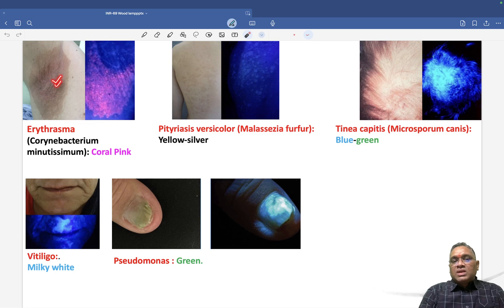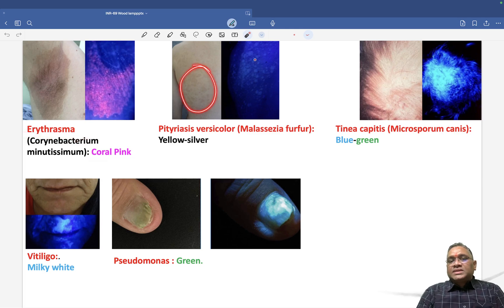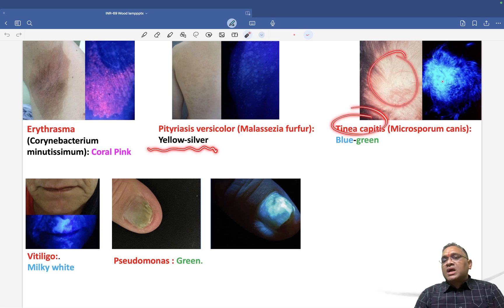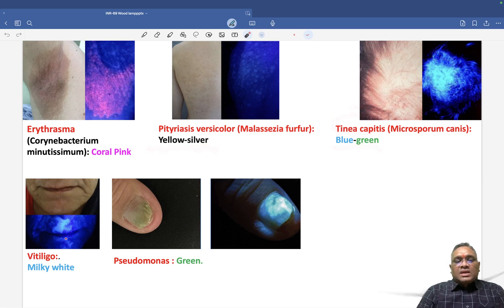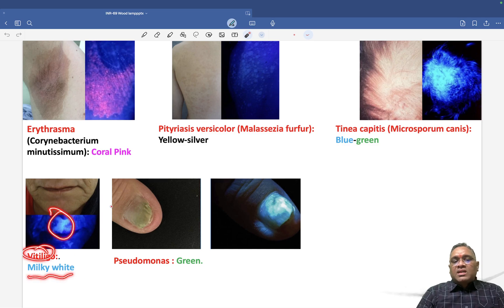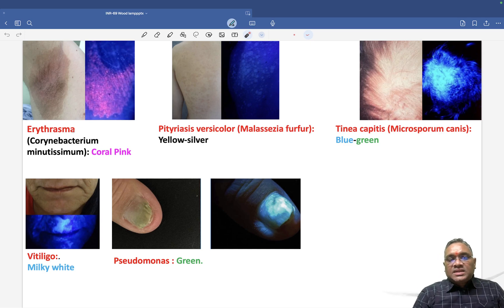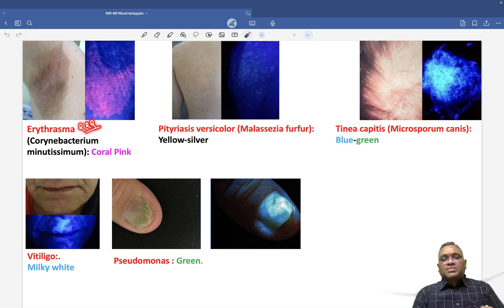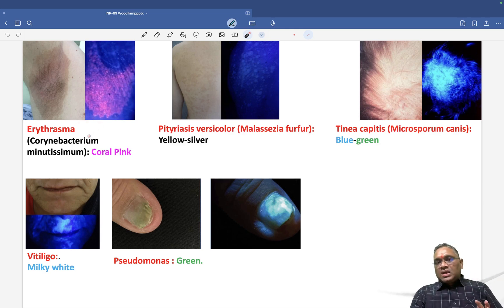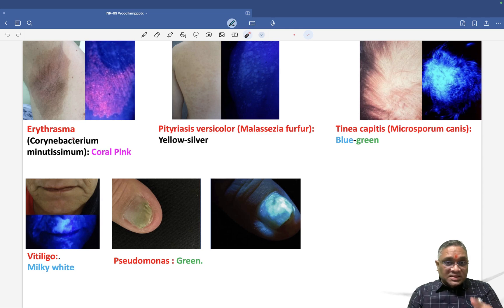You can see the normal skin versus the coral pink color of erythrasma here. Pityriasis versicolor shows yellow-silver appearance, tinea capitis shows blue-green color, vitiligo shows milky white, and pseudomonas shows green color. The most frequently asked question is erythrasma or Corynebacterium minutissimum showing coral pink color on Wood's Lamp examination. Keep revising this important exam topic.